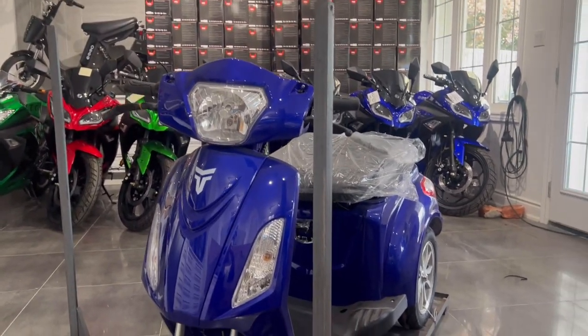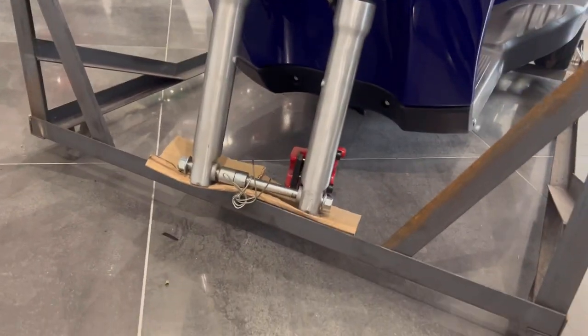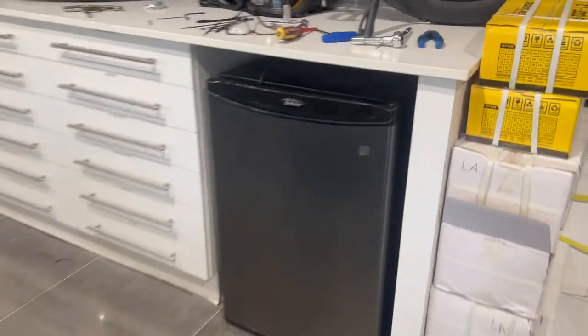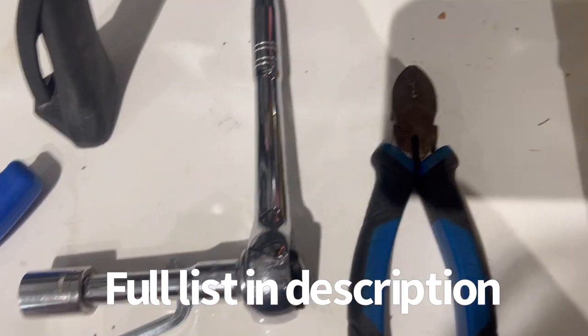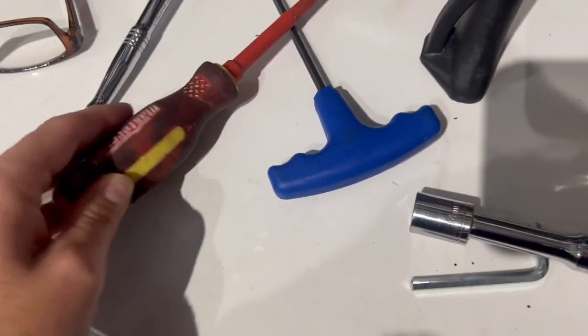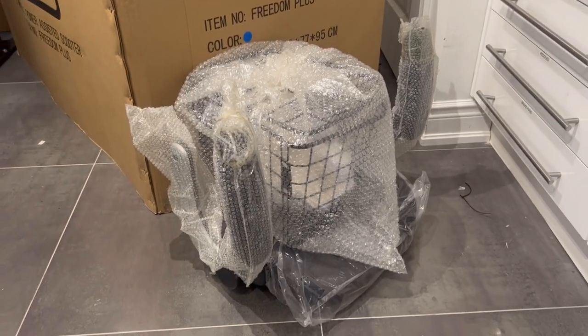We've already taken it out of the box and Darren's taken off a couple of the brackets for the crate, so this is how it is secured to the frame. Here's what you need: a 10mm wrench, an allen key, and clippers — I call it a star, I haven't learned what they are. These just came with your basket and your seat.